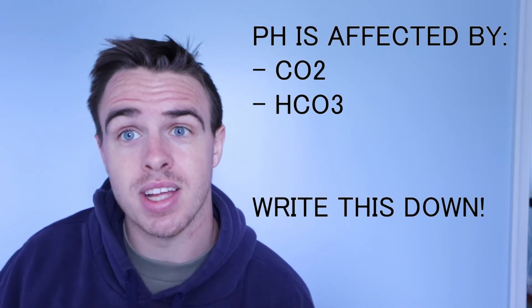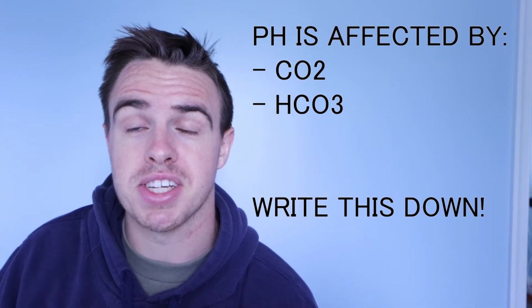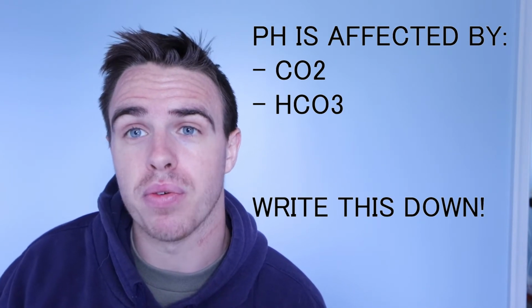So let's stay focused on pH right now, but let's take a little bit of a deeper dive. If we look at the regular pH scale, we know that anything below 7.35 is going to be acidic. Anything above 7.45 is going to be alkalytic. And like I said, the two things affecting the pH are the CO2 and bicarb. So let's just focus on those three things right now. We're just going to look at pH, CO2, and bicarb. Let's start out with just one at a time. So let's start out with CO2 and pH.